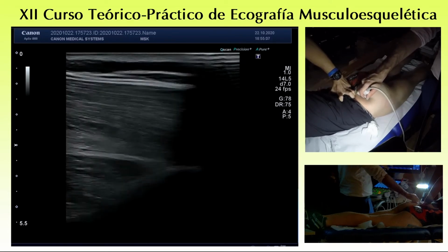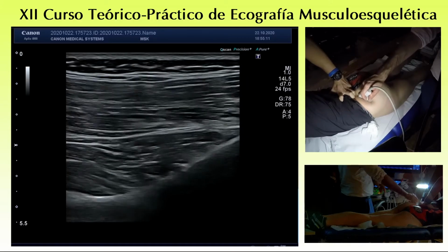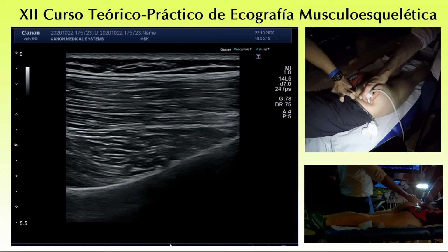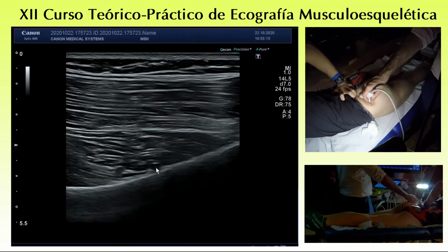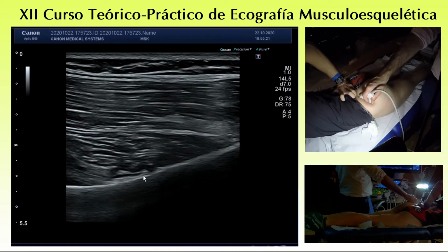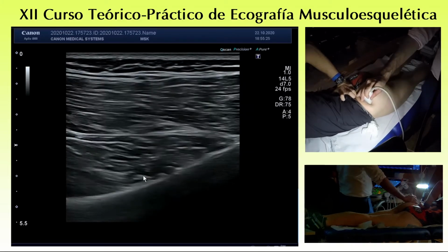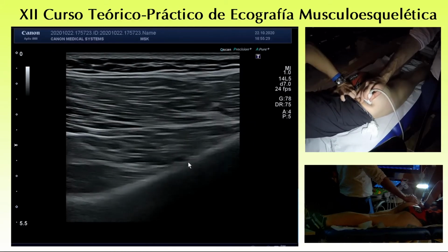This is the aspect of the iliac bone, just here. The vessel you see here in this point is the superior gluteal artery, with the close, of course, as always, the superior gluteal nerve. That is quite important because it innervates gluteus medius, gluteus minimus, and the tensor fasciae latae.